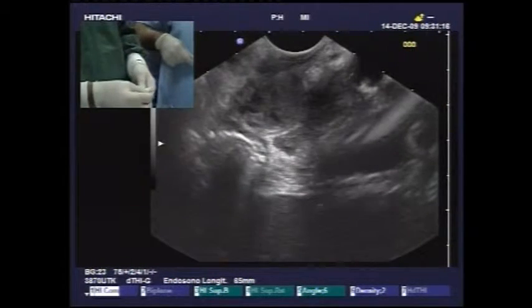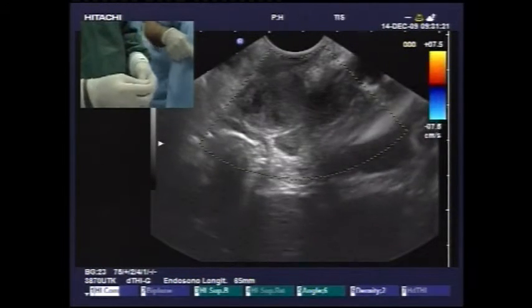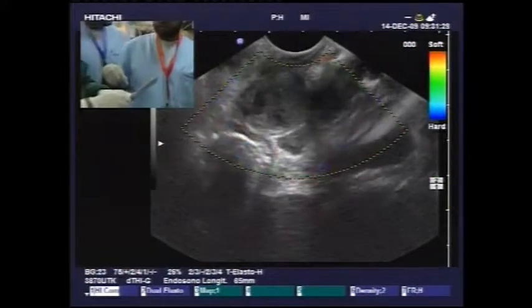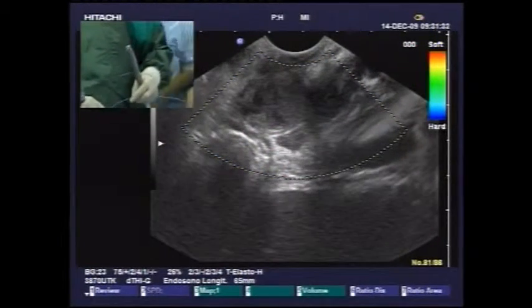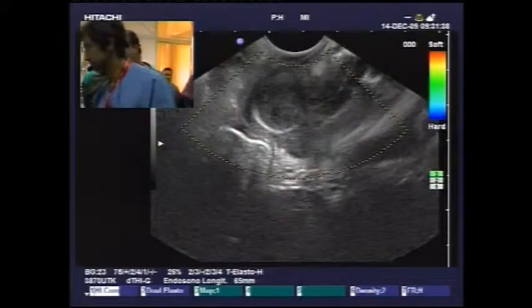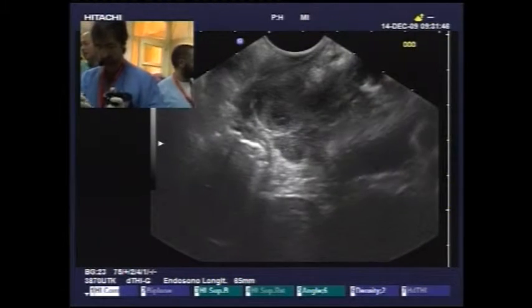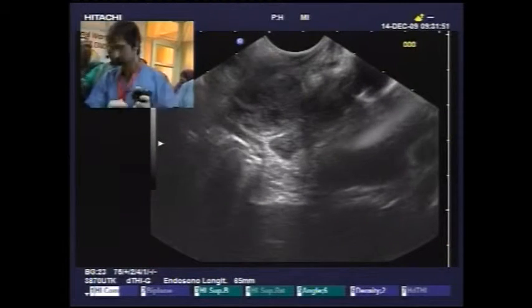Dr. Reddy? We need to see the picture of the screen in a good position. Oh, you're not able to see the picture? The fluoroscopy is not very clear from here. Can you push the wire inside? X-rays are not very clear. Can we see the tip of the endoscope? Please, the tip of the endoscope. Yeah, I think your picture clarity is not very clear there.